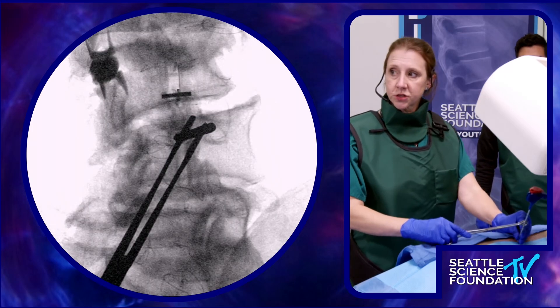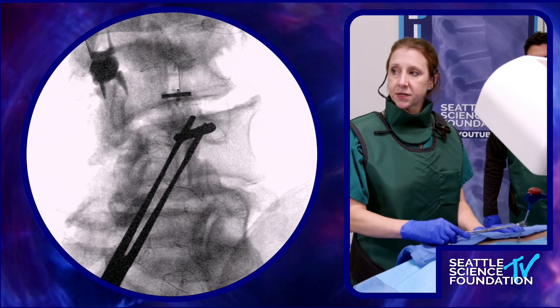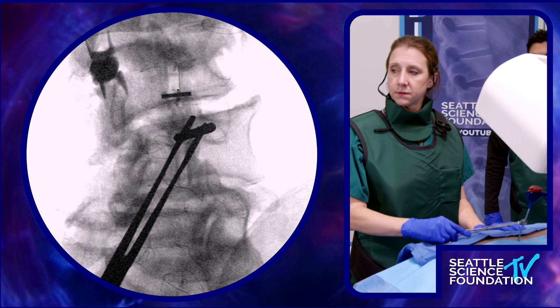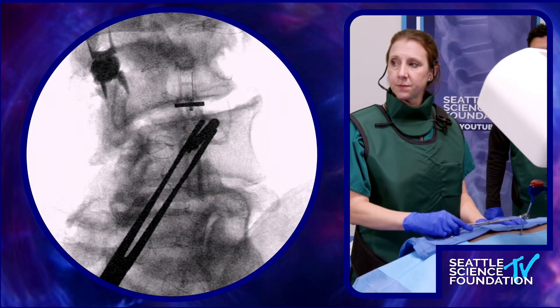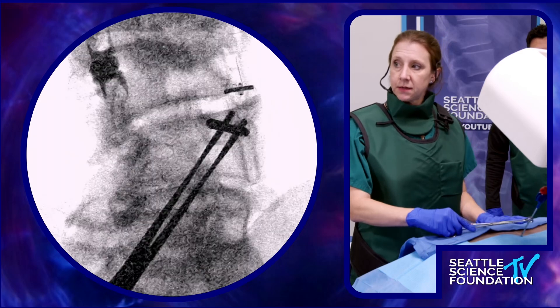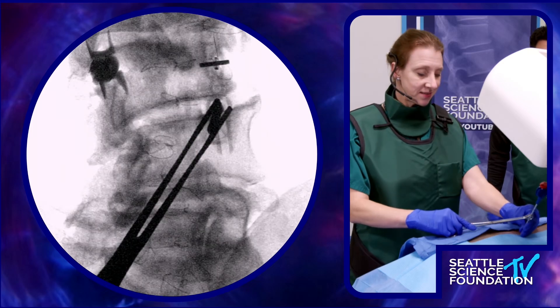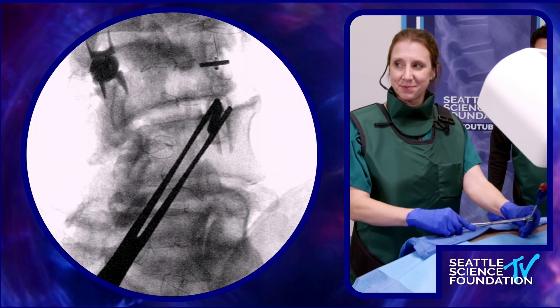What I'm going to try to do is dock this. I've selected the bevel tip introducer cannula because in my experience, whenever I start with the diamond tip, I switch to the bevel tip anyway, to be honest.